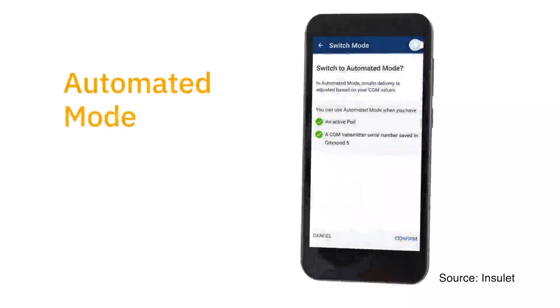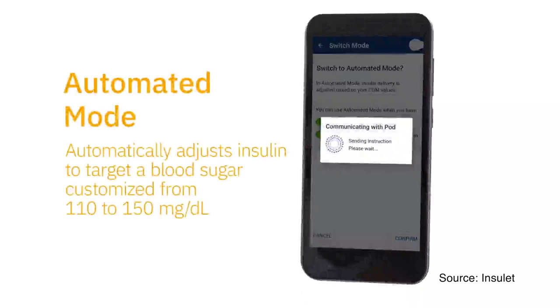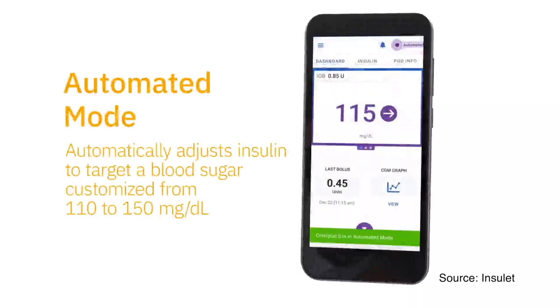You really only need your handheld controller — what you're controlling the system with — to announce a meal. Omnipod 5 has a customizable glucose target between 110 and 150 milligrams per deciliter. So you can set the system to keep you at 110 at night or 130 during the day and adjust as you wish.